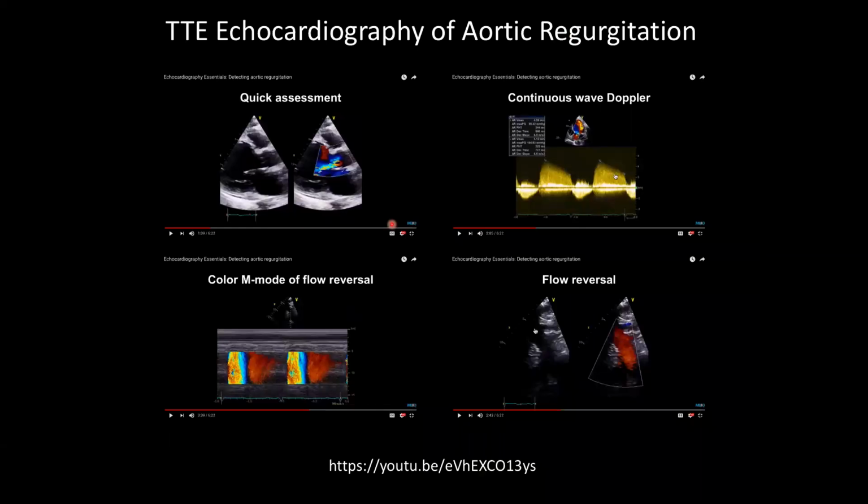Right? We looked at this using echocardiography in aortic regurgitation briefly. And when you look at the velocity spectrum right down the aorta, you can see the peak velocity as it's ejecting, and then the decay away of the velocity, that is the regurg.